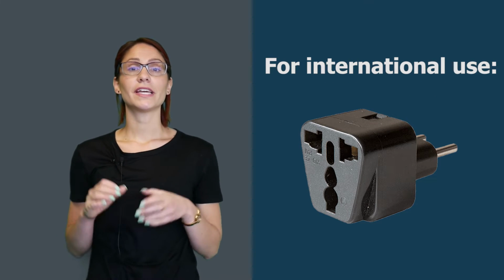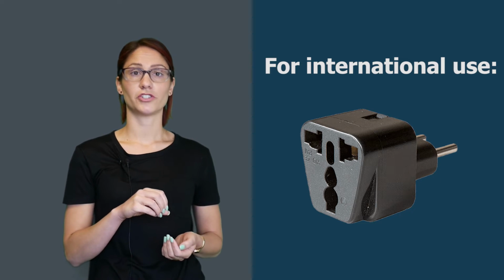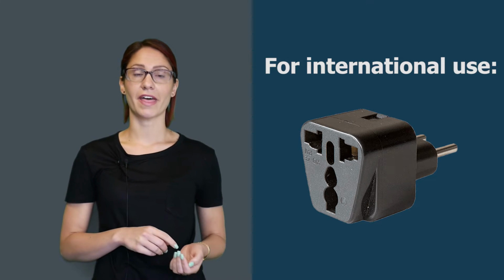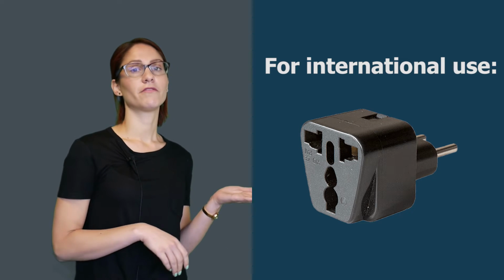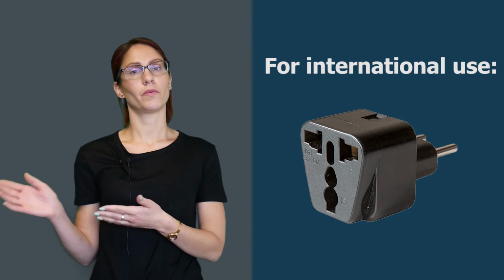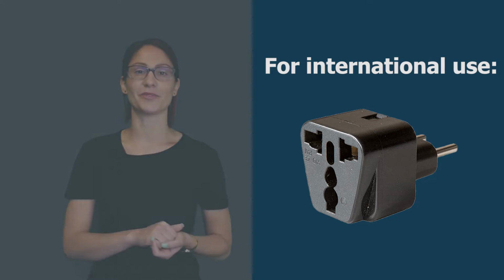And remember, if you're traveling internationally, you will most likely need a different prong to plug into the wall. So make sure you're covered with that. Most portable oxygen concentrators will go from 110 volt all the way up to 240, so you won't need a converter, but you will need a different prong to connect it to the wall.